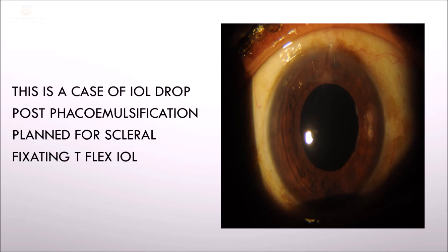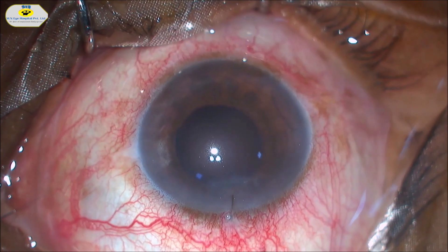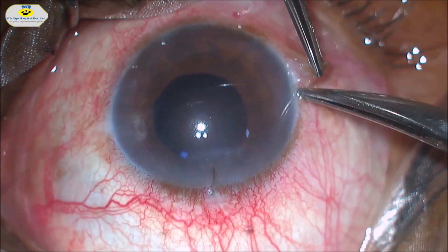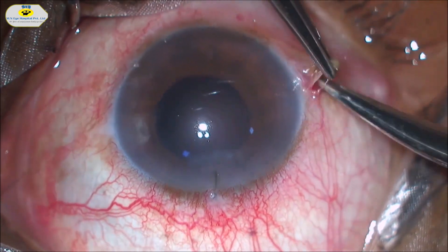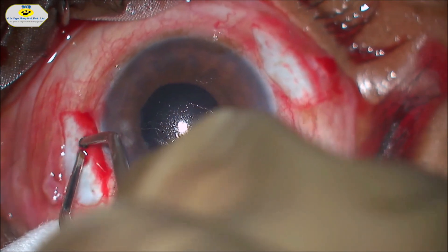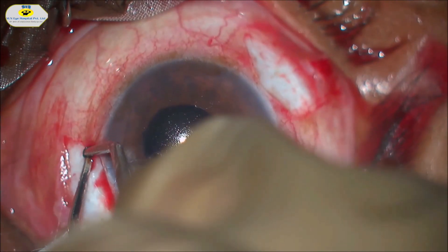This is a case of IOL drop post-phacoemulsification, planned for scleral fixation with a T-flex IOL. Conjunctival peritomy is done on either side, and bleeding vessels are then cauterized.